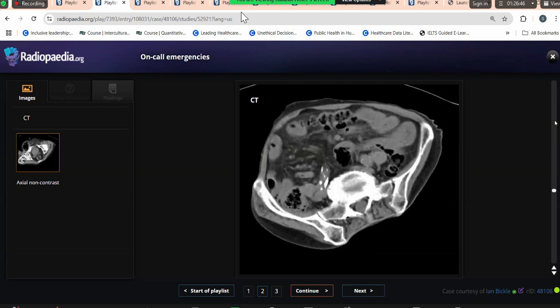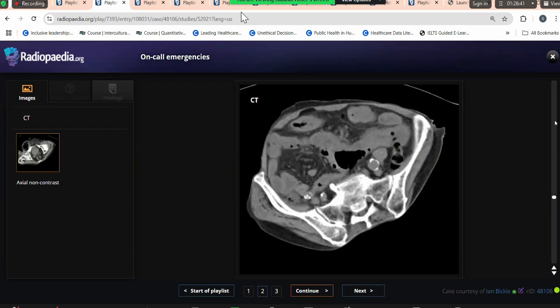Sorry, ma'am, is it just the history of acute presentation, or is there any history of trauma? No, there's no history of trauma. There's acute abdomen.